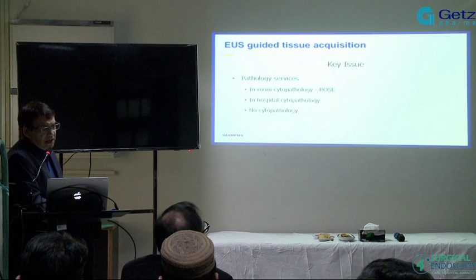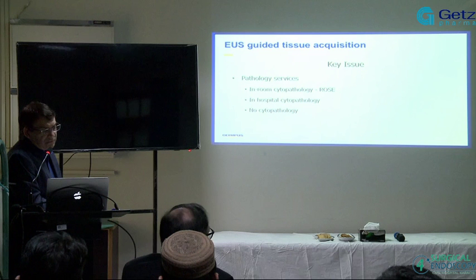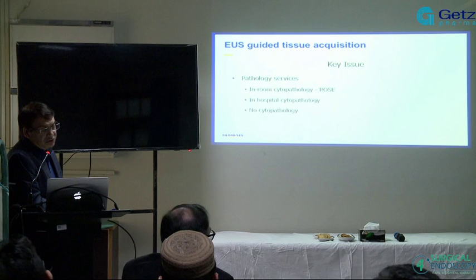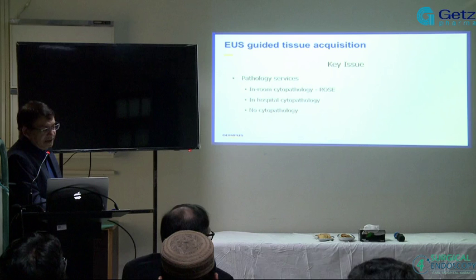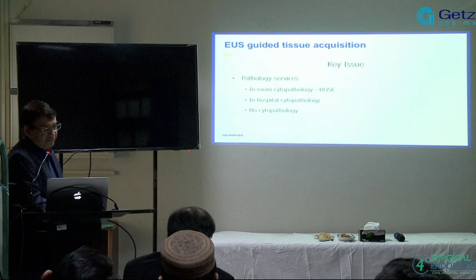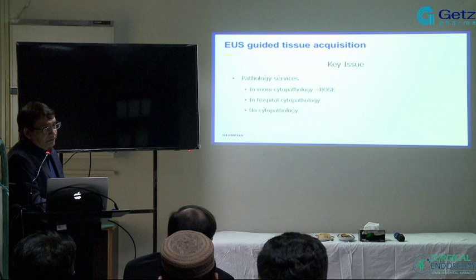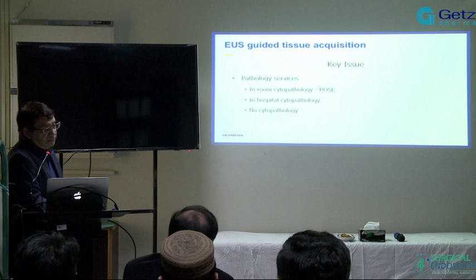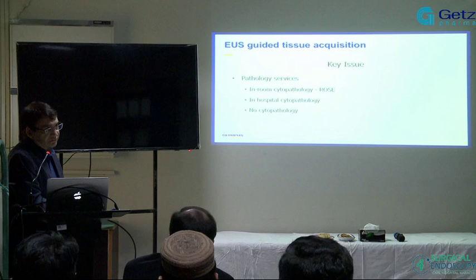Obviously, it has been proven that it does increase your chances of having a positive specimen, but it's not inexpensive. And this is what we call ROSE, rapid on-site evaluation, and that's the main purpose. That's one thing if you have it available. Other is, is the cytopathologist available in the hospital? That is also very helpful if at least they are available and you can call them when needed.